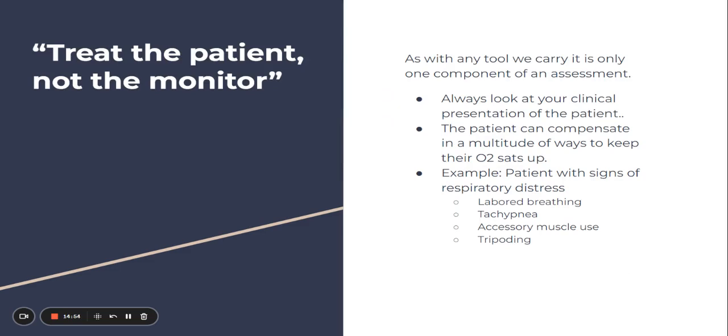So that is to say, treat the patient, not the monitor. This is something that you will hear over and over again. Pulse oximetry, like all of our tools, is just a tool. It's only one part of our assessment. That doesn't trump your clinical interpretation of the patient, your clinical presentation of the patient. Patients can compensate in a multitude of ways to keep their sats up.